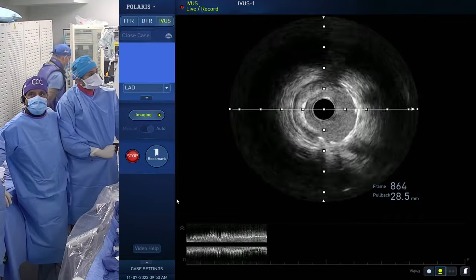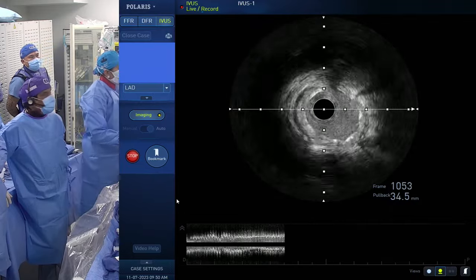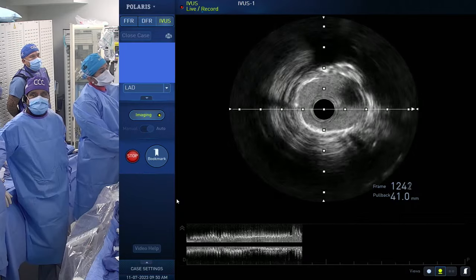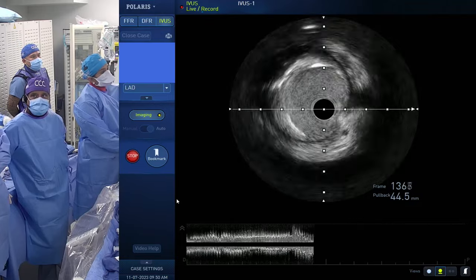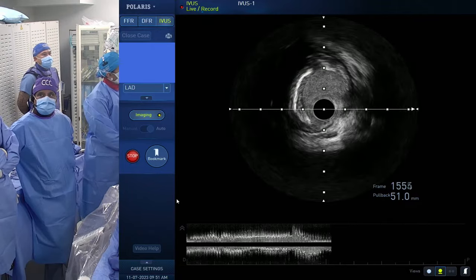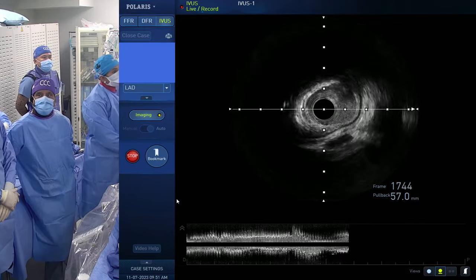This is still after the bifurcation. No, let's look there. Are you at the level of the crush now? Reaching. Yeah, now I see it from the 3 o'clock. This is the bifurcation. Looks like the branch is open. Now the lumen is getting bigger. Now it's a native lesion, an eccentric calcified lesion. We'll have an angio-IVUS co-registration, which we have for OCT. Yeah, this is the lumen.